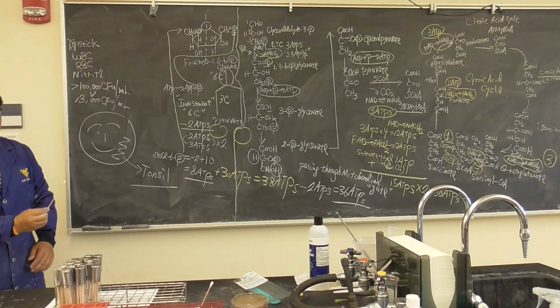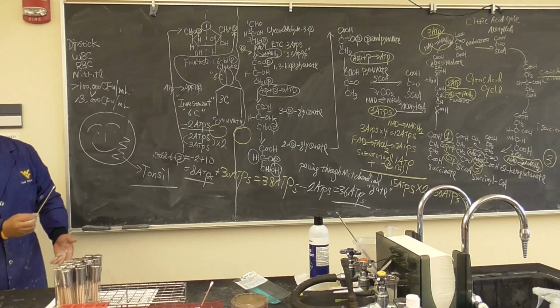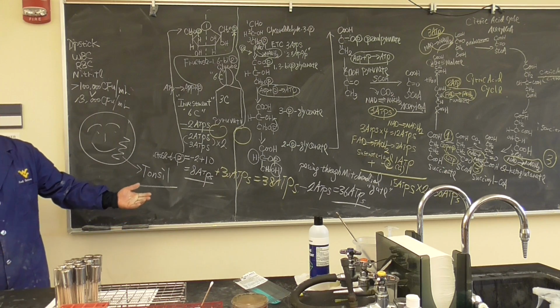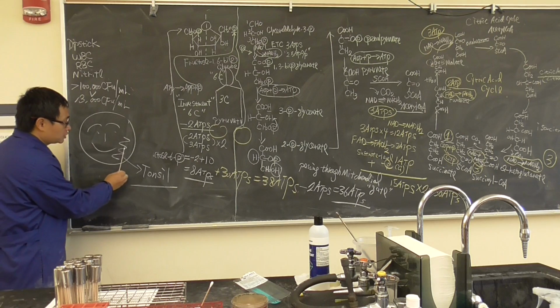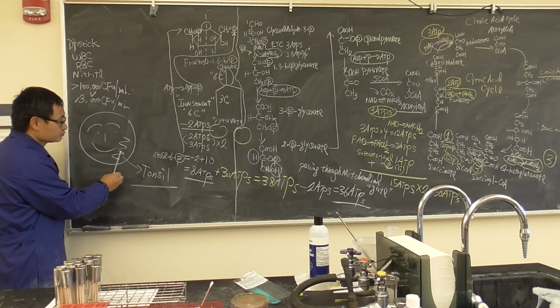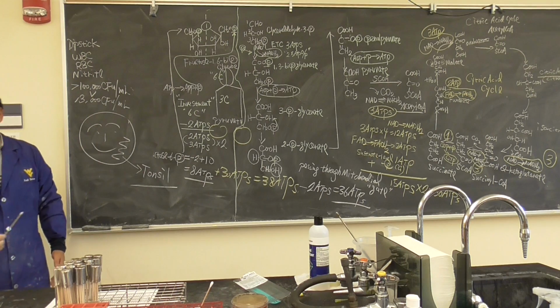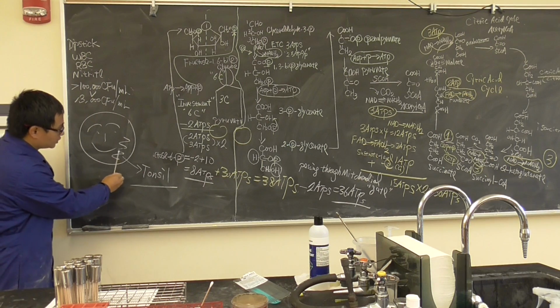Because if you touch the teeth, the oral cavity, then you have millions of bacteria. Remember, that's a very dangerous streptococcus. Millions of bacteria. I want to touch your tonsil area, very gentle. If you're sick a little bit these days, which will be better? Okay, then you get here.